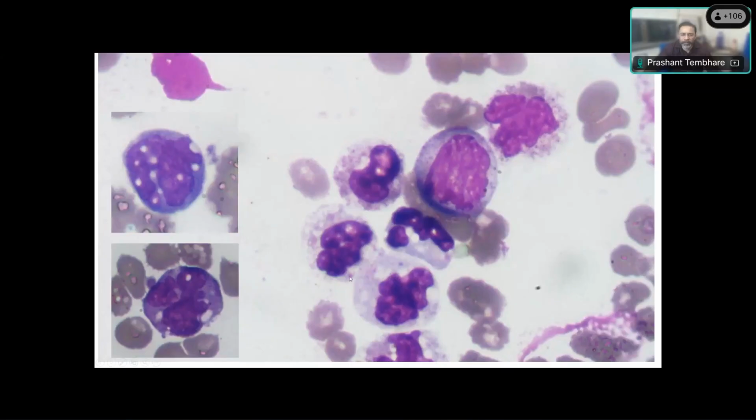You can see possibly some hypogranulation is there. One or occasional immature cell you can also see in the circulation. This looks like a myelocyte. These are the monocytes. You can see the increased monocytes with vacuoles.